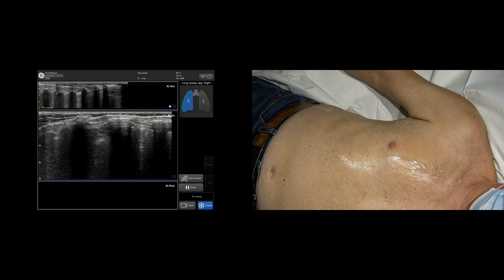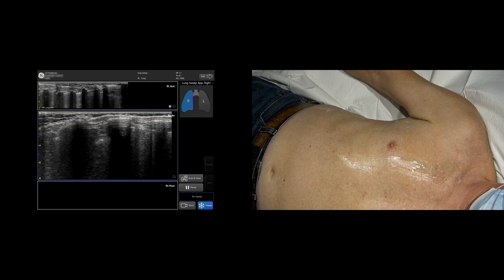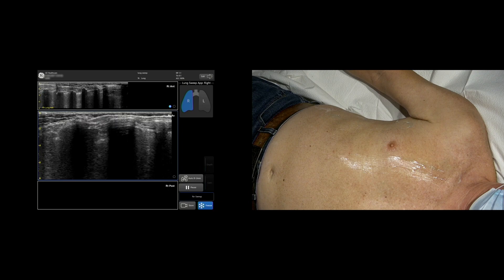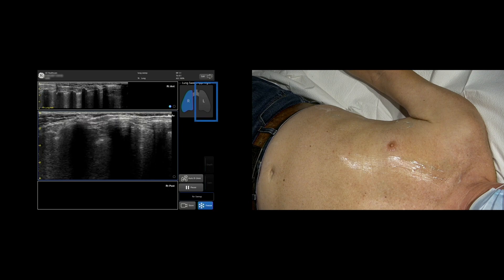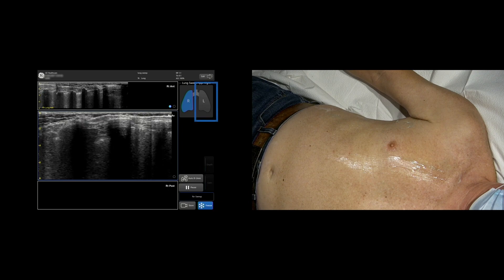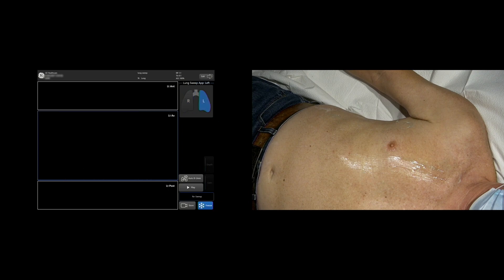Perform lung sweeps on the other side of the patient — in this case, the left side. Tap left on the lung diagram and continue sweeping each desired lung view.